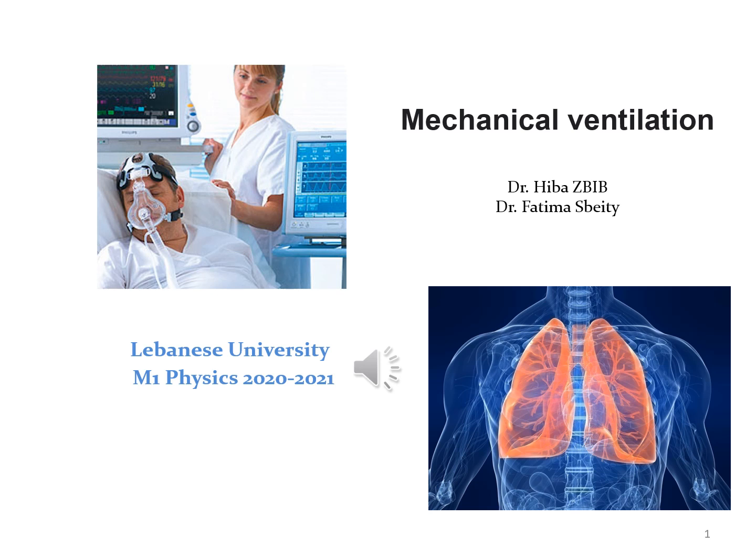In this presentation, I will talk about mechanical ventilation. Ventilation is the process by which the lungs expand and take in air, then exhale it. A mechanical ventilator helps with this by pushing air into the lungs from an external device through a tube that is inserted into the patient's airway.